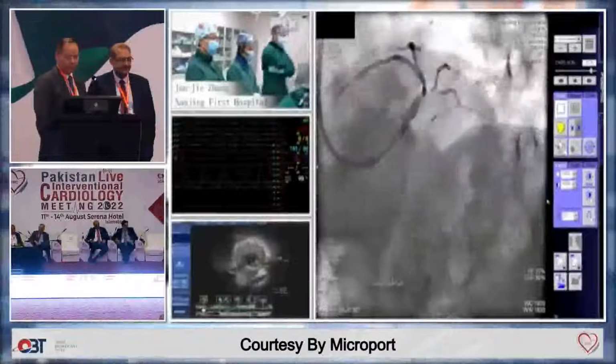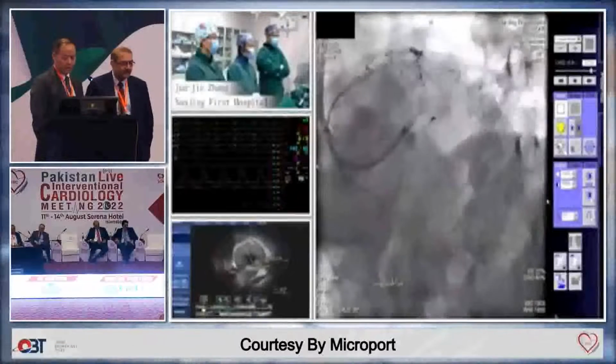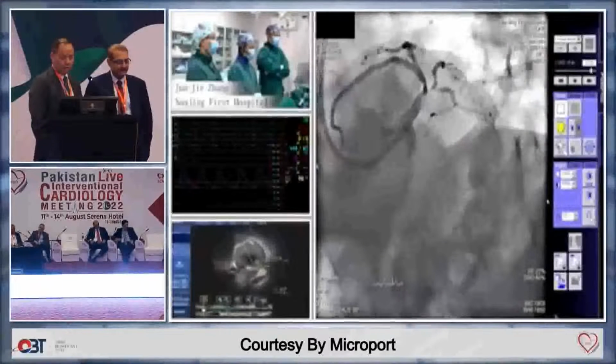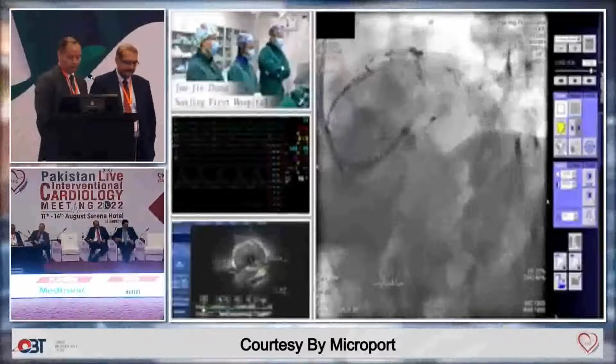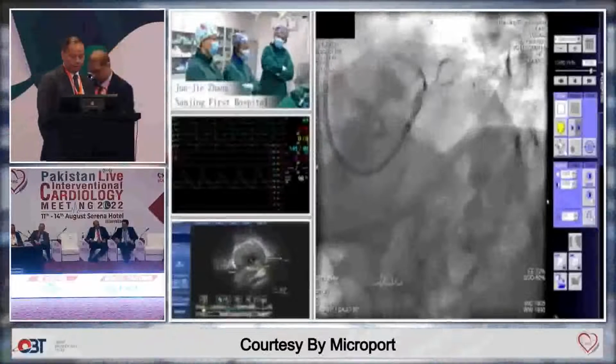Actually, we didn't do the predilatation. According to the pre-decision strategy, we performed the IVUS evaluation. So let me let Dr. Anton introduce the baseline IVUS from the LAD, OM, and the circumflex. So please, Anton, introduce the IVUS.